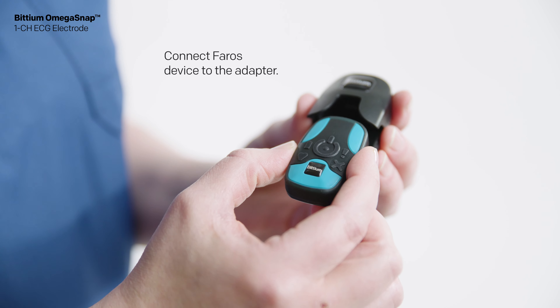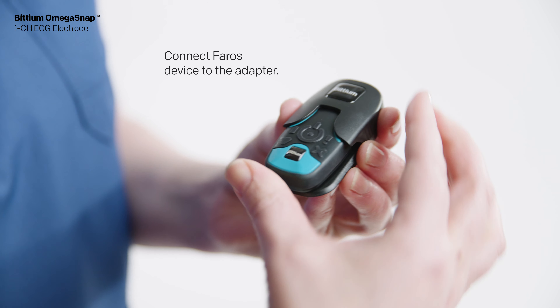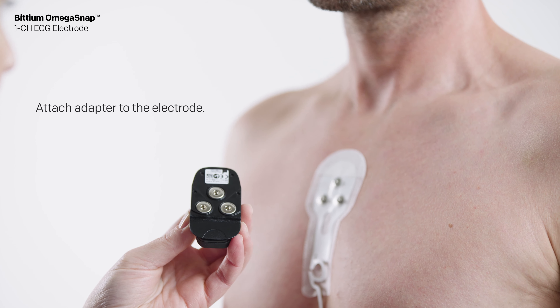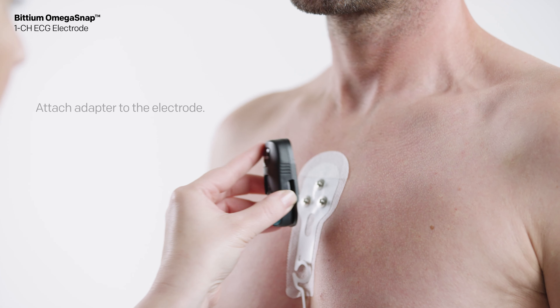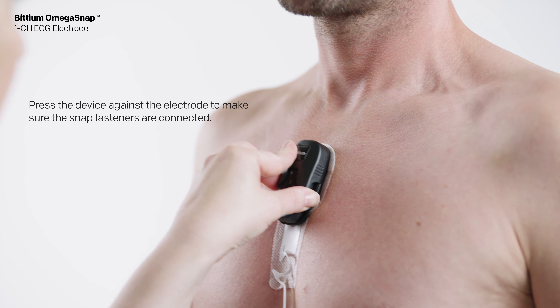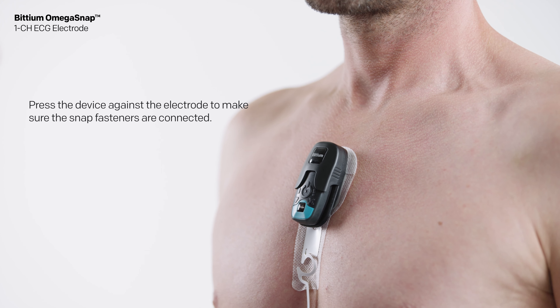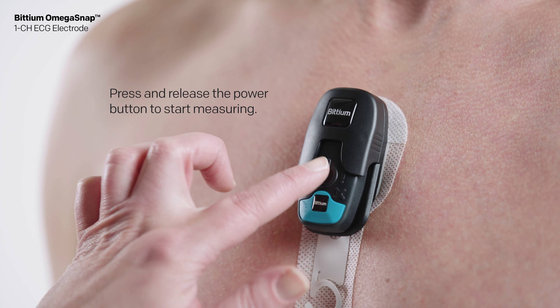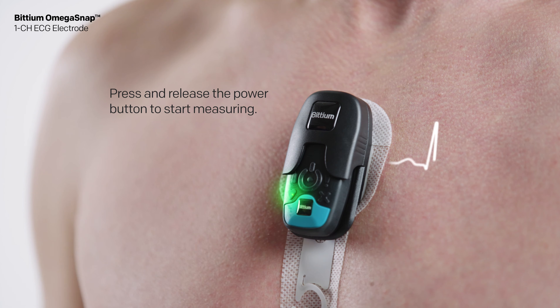Connect the Faros device to the adapter. Attach the adapter to the electrode. Press the device against the electrode to make sure the snap fasteners are connected. Press and release the power button to start measuring.